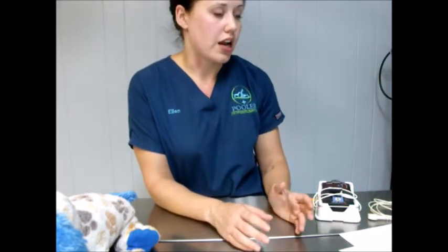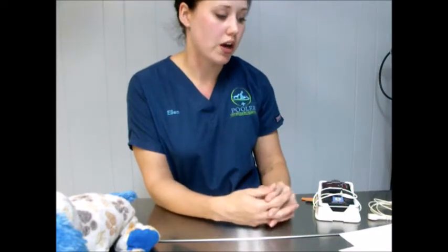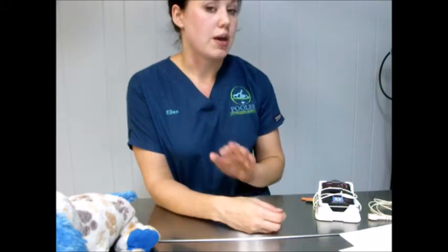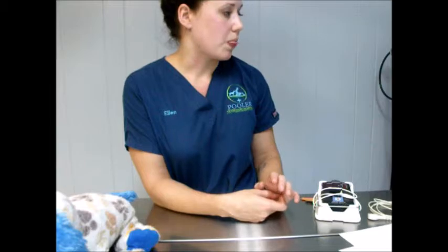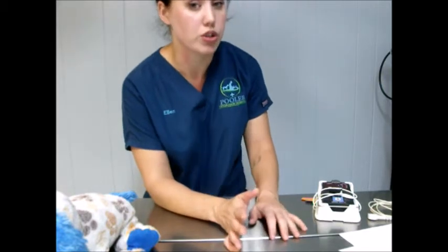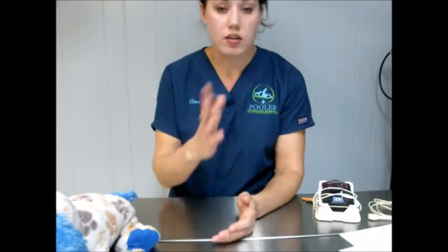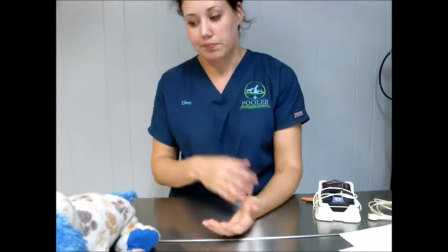Since it's such a good indicator of tissue perfusion, you have to watch the trends with it to see where it's going. A lot of times when you start out, a lot of the anesthetic agents will decrease blood pressure, so you have to make sure that it is going up as you take the readings. One of the main ways to bump that blood pressure up, of course, is to decrease anesthesia. Hypotension is commonly caused from too deep of an anesthetic depth, and increasing fluid rate means you're getting more fluid through the body, better tissue perfusion.